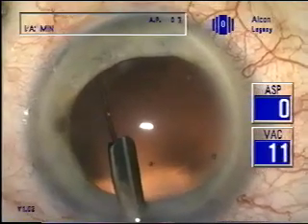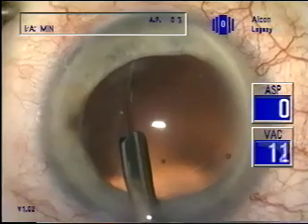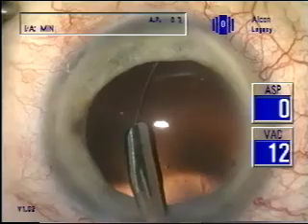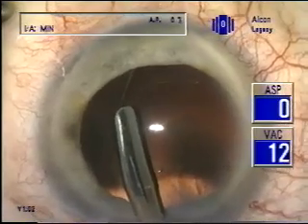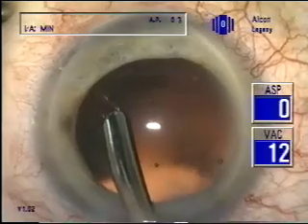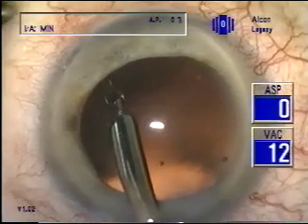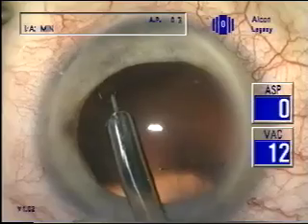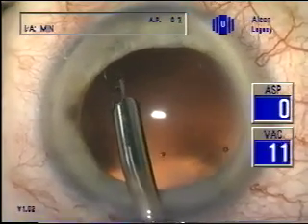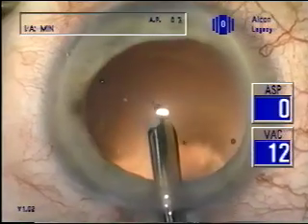You'll note that as it comes out of the cannula, the loop shows engagement with a hook at the end that is now being released. This facilitates placement of the loop in the capsular bag.